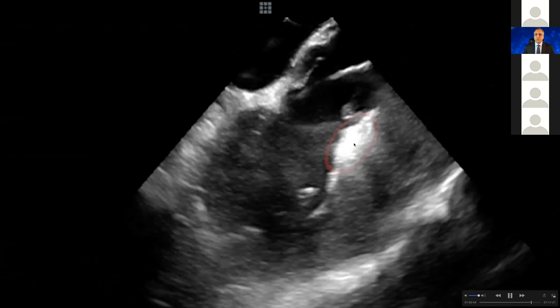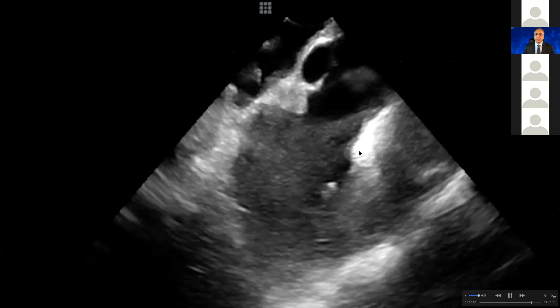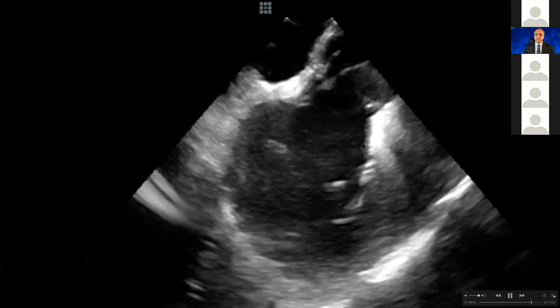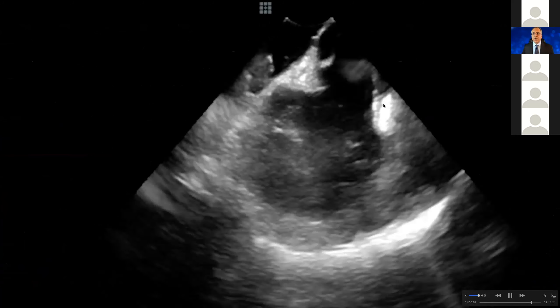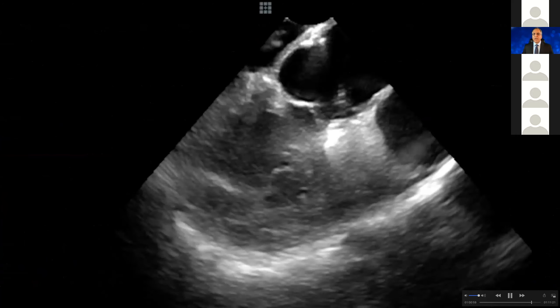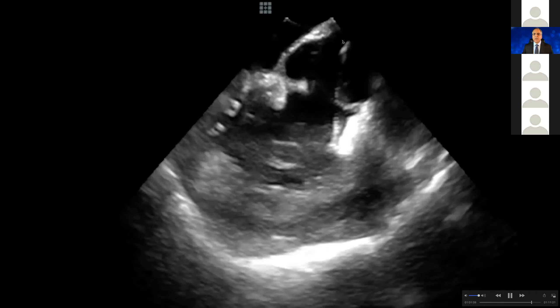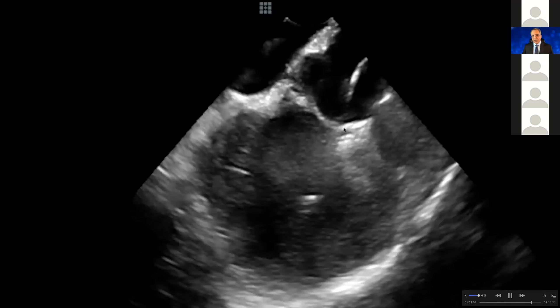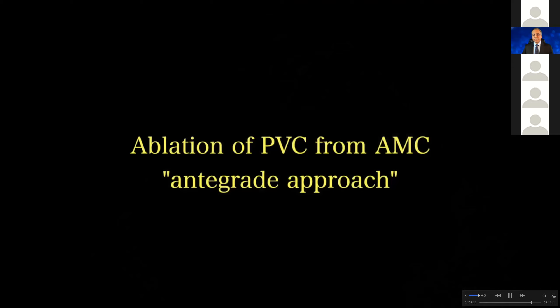Look at this — you can see how nice this lesion is, and the ablation catheter is very snug with the tissue. You can release the curve and go straight on top of it and touch it this way. Here you can see my catheter going straight — I pulled and released the curve.